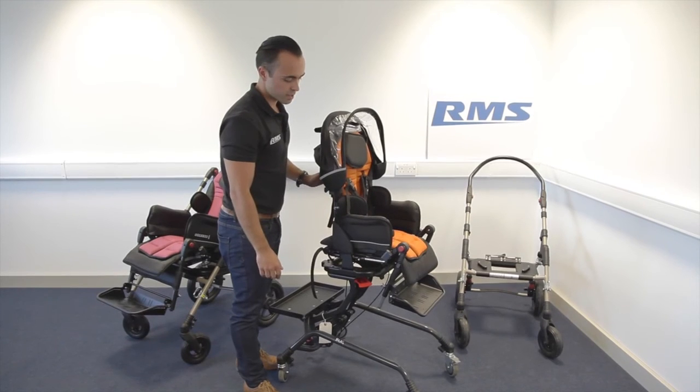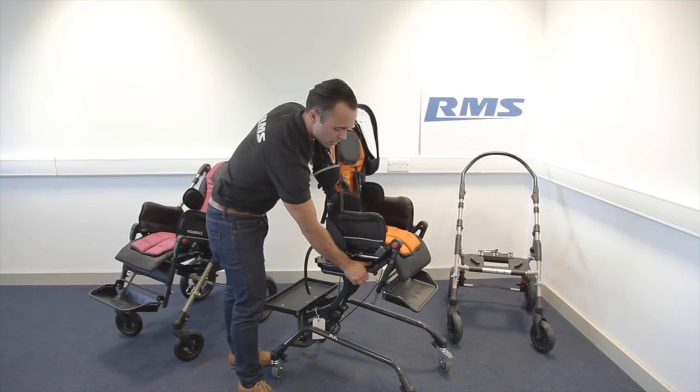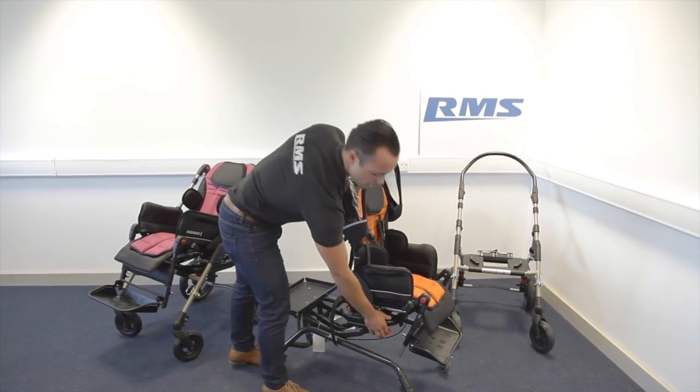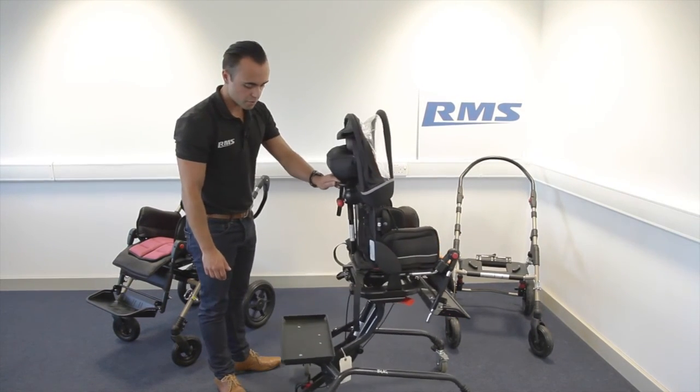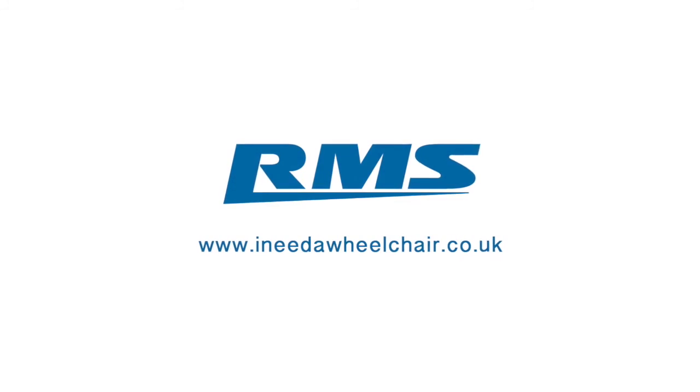With the high-low base, to go up and down you just need to press this red lever. Down it's locked, and then up. You still have room for storage here with this solid platform.